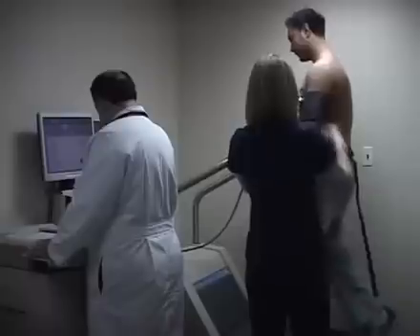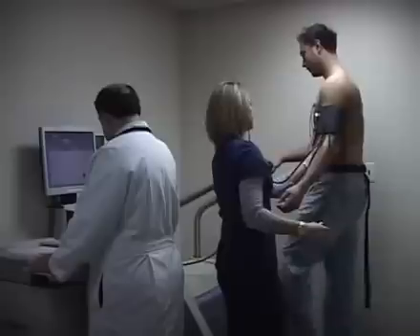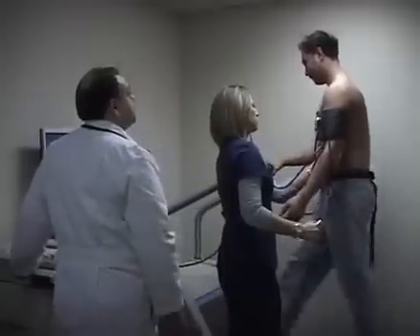The way the stress test is being done is we look at the heart with ultrasound before we start the exercise. We take a few specific pictures to look at the valves, to look at the walls of the heart, and make sure they're functioning appropriately.